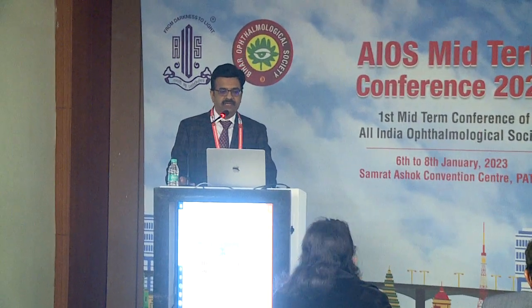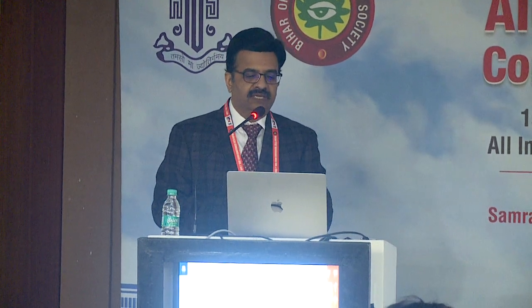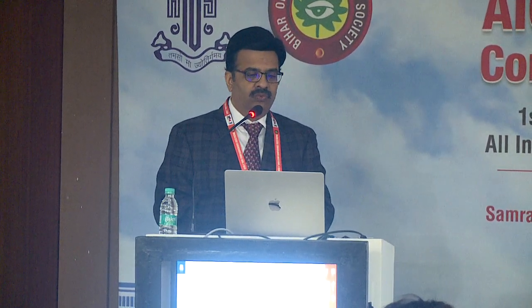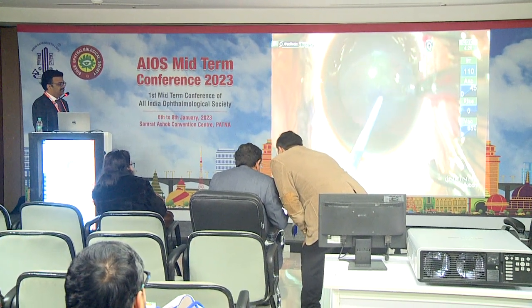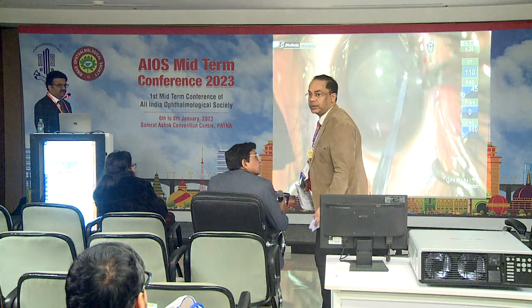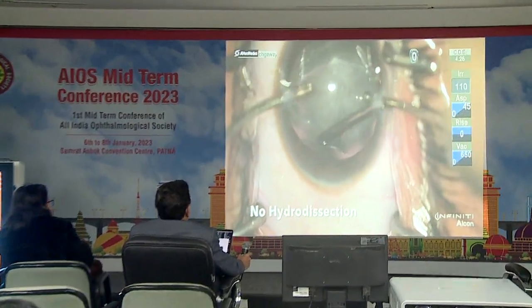Thank you, sir. The topic on which I would be speaking is managing pre-existing PC defect. So we'll start with a pediatric eye, and what you see here is a posterior lenticonus, which is very clear on examination, so no doubt about it.